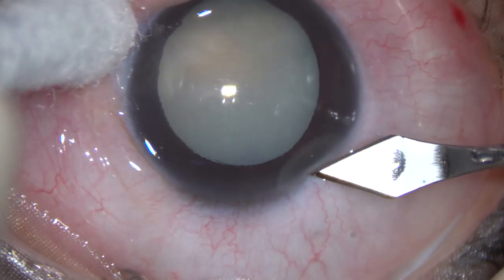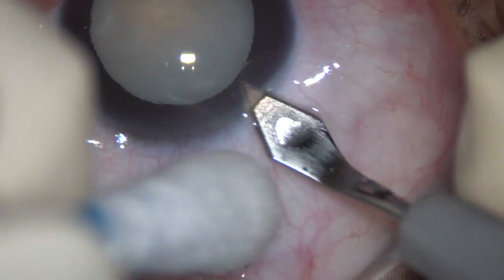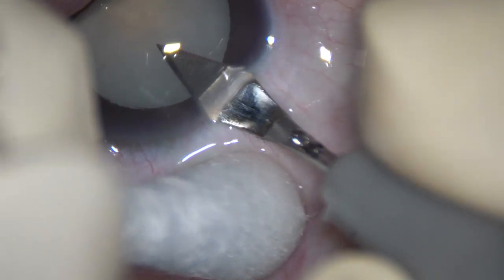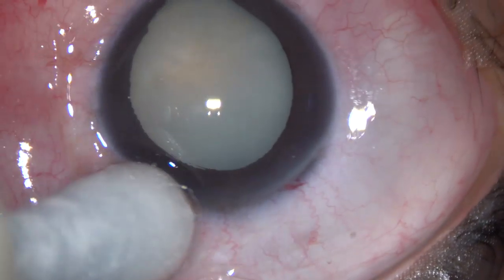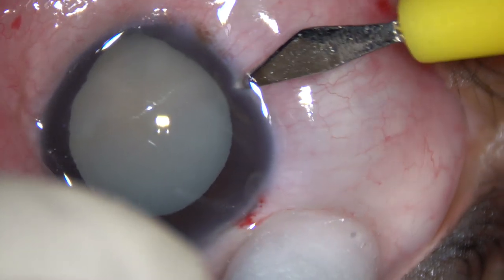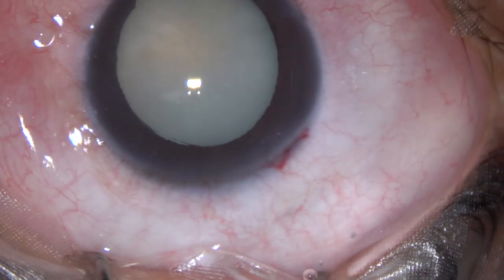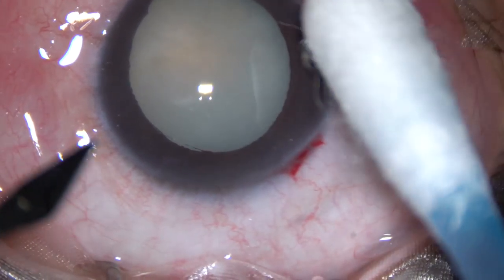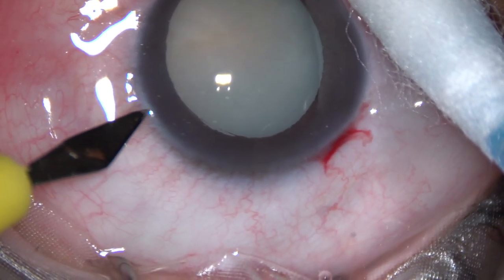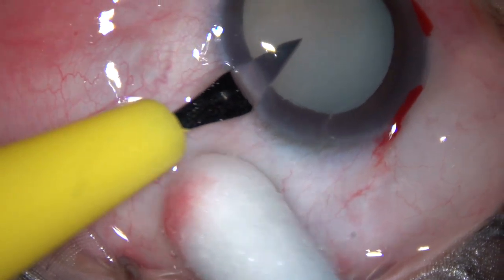This is the main incision on the posterior aspect of the limbus with a 2.8 mm steel keratome. The incision is at around 11 o'clock. This is a side port on the right side of the main incision, about 3 clock hours away. And this is another side port on the left side of the main incision at about the same distance away.